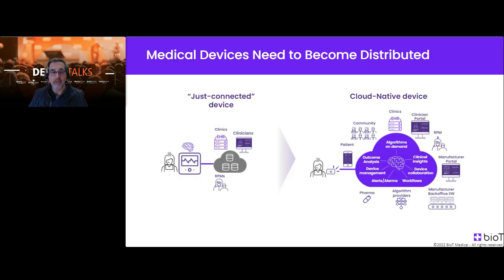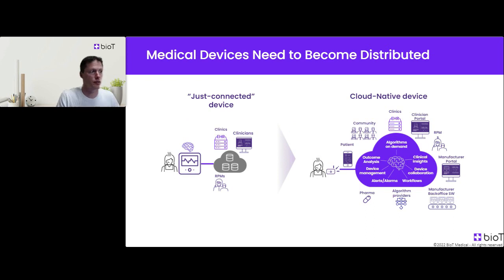Okay. So the short answer is that medical devices need to become distributed. From this first evolution to connected care, where you usually took an existing device and just retrofitted it to connect to the cloud, so clinicians can become remote and don't have to look at the screen of the device because they now have a web screen for that. Now this approach is not working because of all the challenges I mentioned around the price.